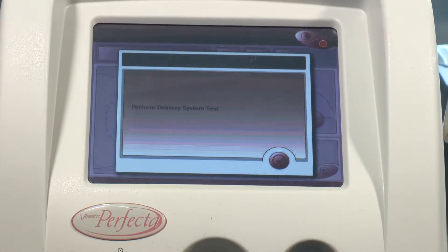So this in-house is the 2006 V-Beam Perfecta. As you can see, we have it powered on here — it's all warmed up — so we're now going to perform the delivery system test.